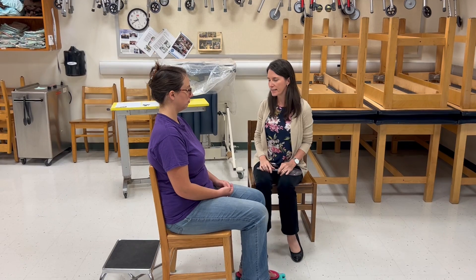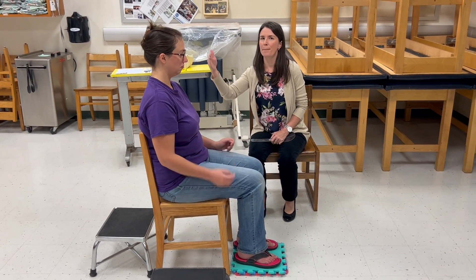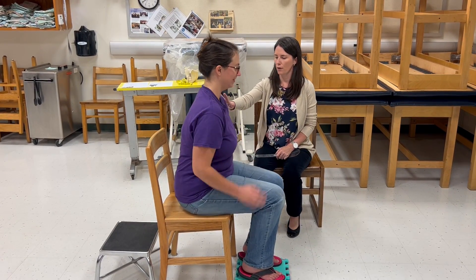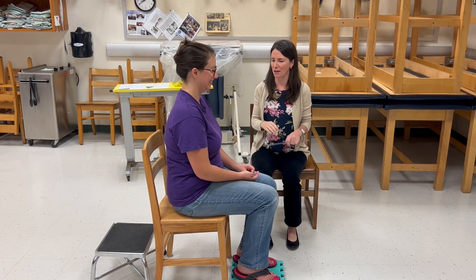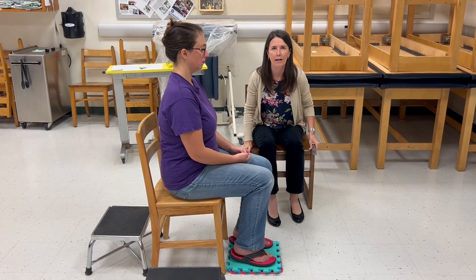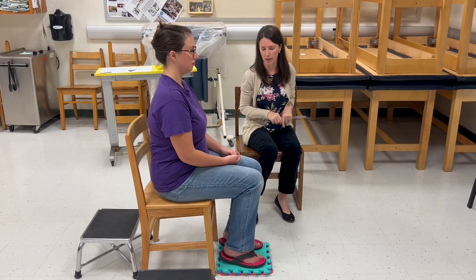The patient position is sitting in a stable wooden chair with feet supported but back unsupported. You want them to come forward two or three inches — you don't want them leaning against the back of the chair because you don't want the back of the chair to impede their ability to go through their full range of motion. If their feet aren't touching the floor, provide a couple of foam squares.